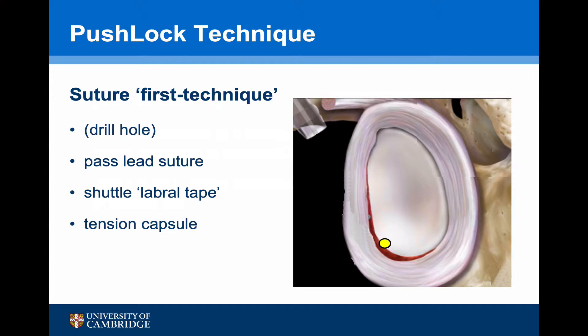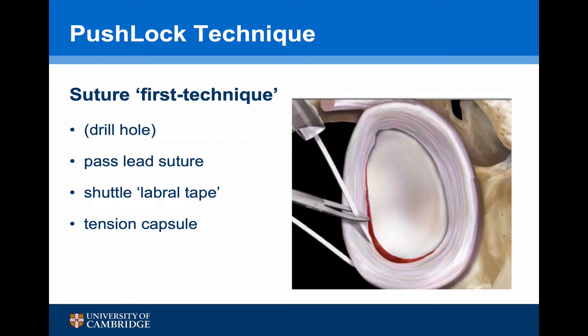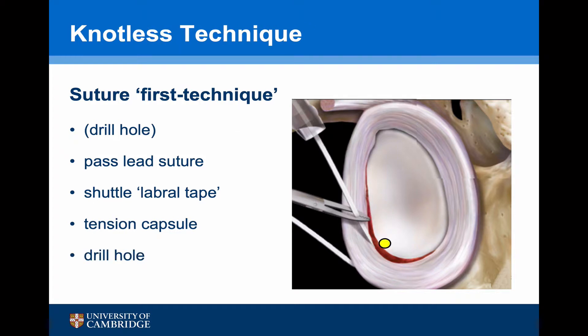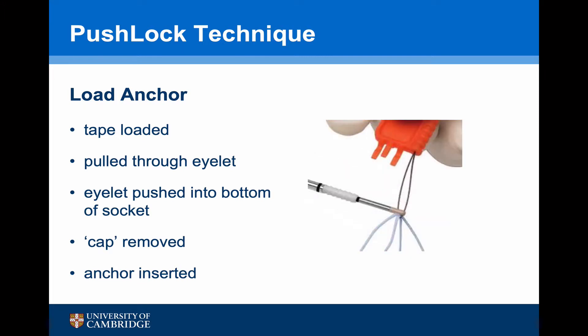This is the drill hole for the first anchor — the inferior anchor at the 4:30 position. Using the suture shuttle system, we take a nice bite of the capsule as inferiorly as possible, then pass the shuttle out, retrieving it through the superior portal. The labral tape is then loaded into the shuttle and pulled through, and the second limb of the labral tape is then pulled out. Having passed the labral tape through the capsule, it now needs to be loaded into the push lock anchor. The anchor has an eyelet at the bottom through which there is a delivery device, and the two tails of the suture are passed through this. The orange device is then pulled through, loading the sutures through the eyelet of the anchor.